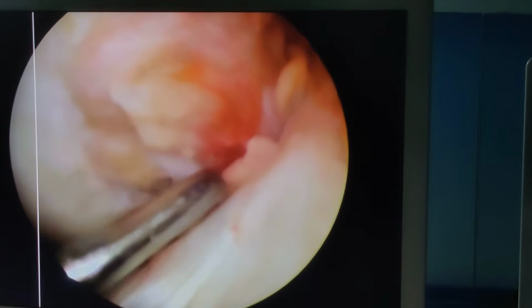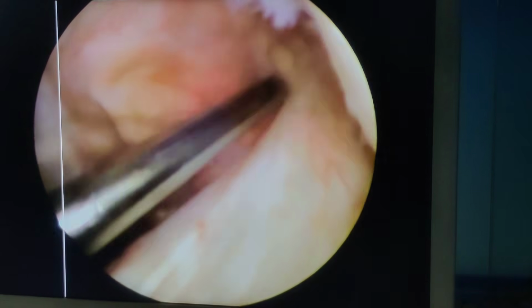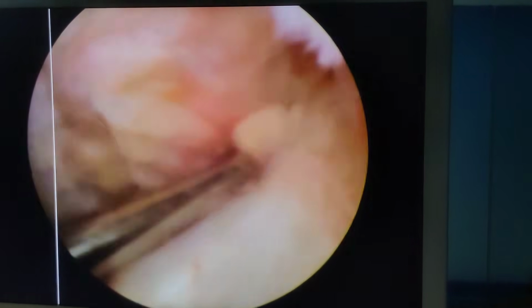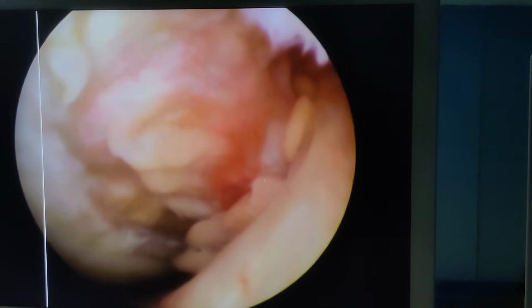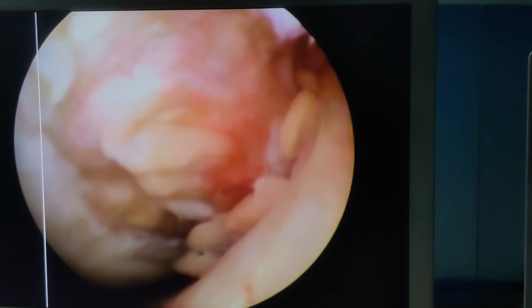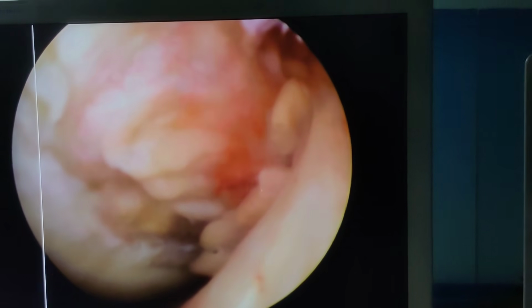Whenever you are dealing with a PCL injury, always examine the ACL. Don't believe reports. Do a clinical examination and do an arthroscopic examination. Now I am going to talk about the bundles of the PCL and how to identify them and where we aim to put our portal.